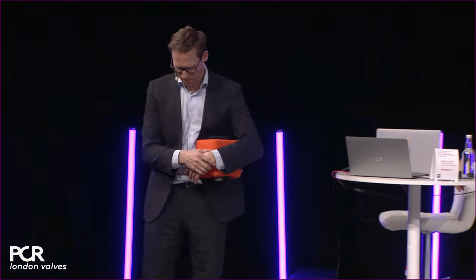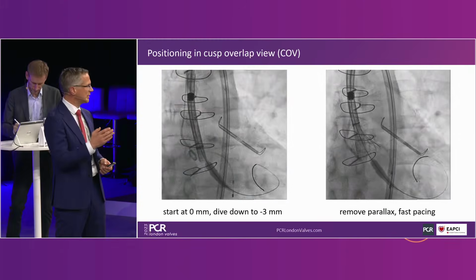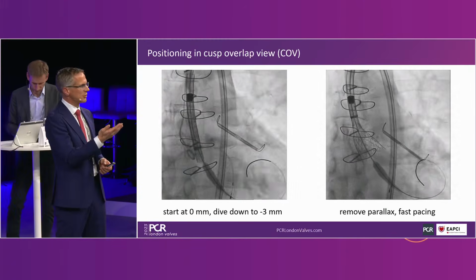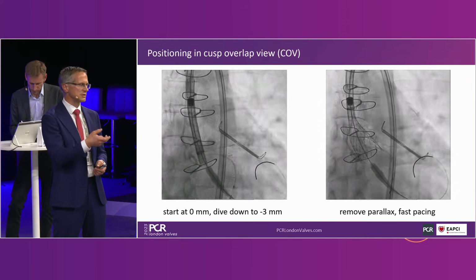Great questions. Okay, question number 1. You come up, you start with your flush port coming in, 3 o'clock. You get to the ascending aorta in LAO. It's not on the outer curve. How do you adjust with the FX? Well, the first movement is a very slight movement coming from 3 o'clock to 2 or 1 o'clock. And then in most cases, you will be able to see in the LAO 30 that the head marker is rotating towards the outer curve.